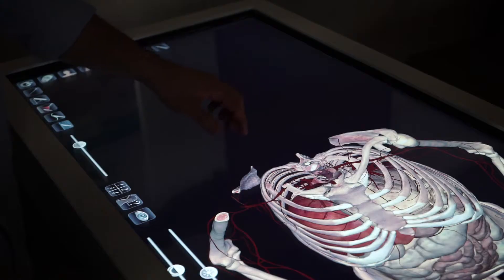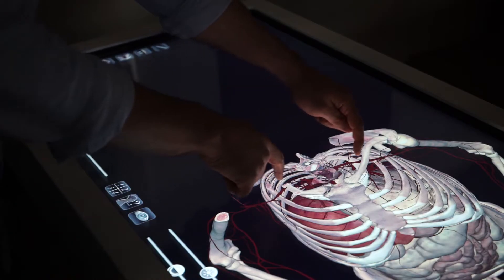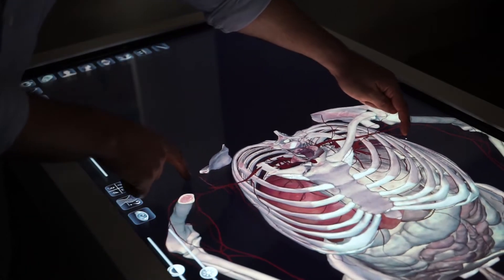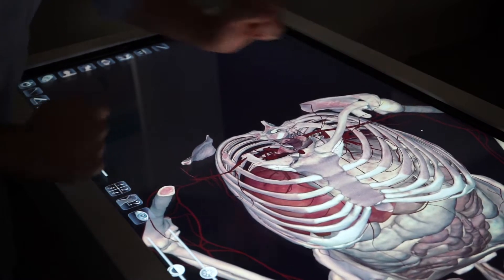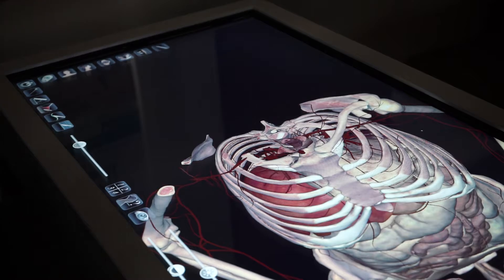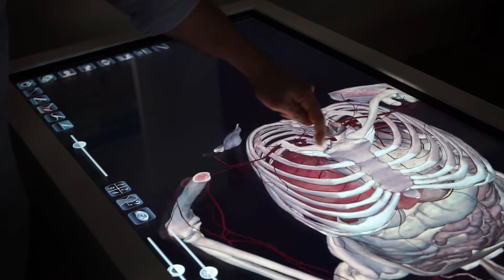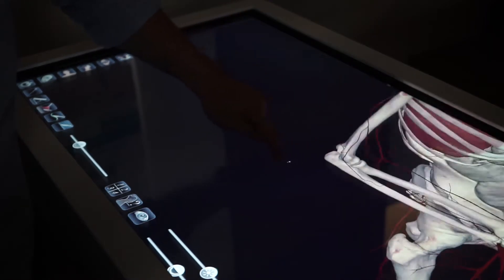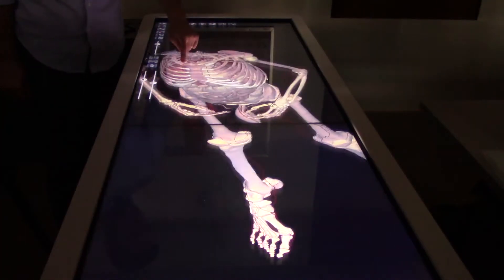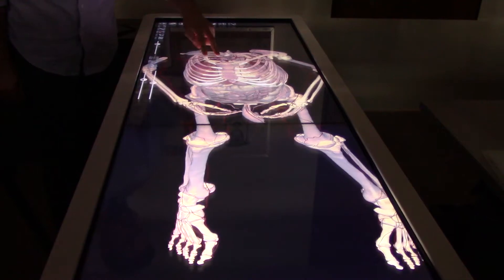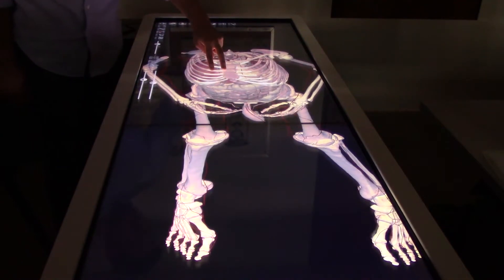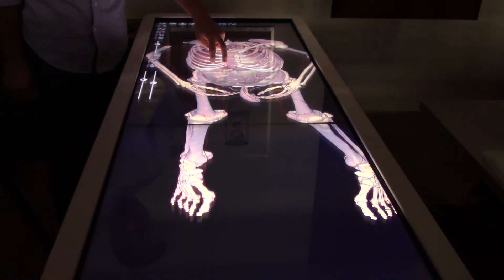I can also zoom in with two fingers to get a closer look. I can rotate the body using one finger, or if I wanted to move the body around the table, I can do so using two fingers.